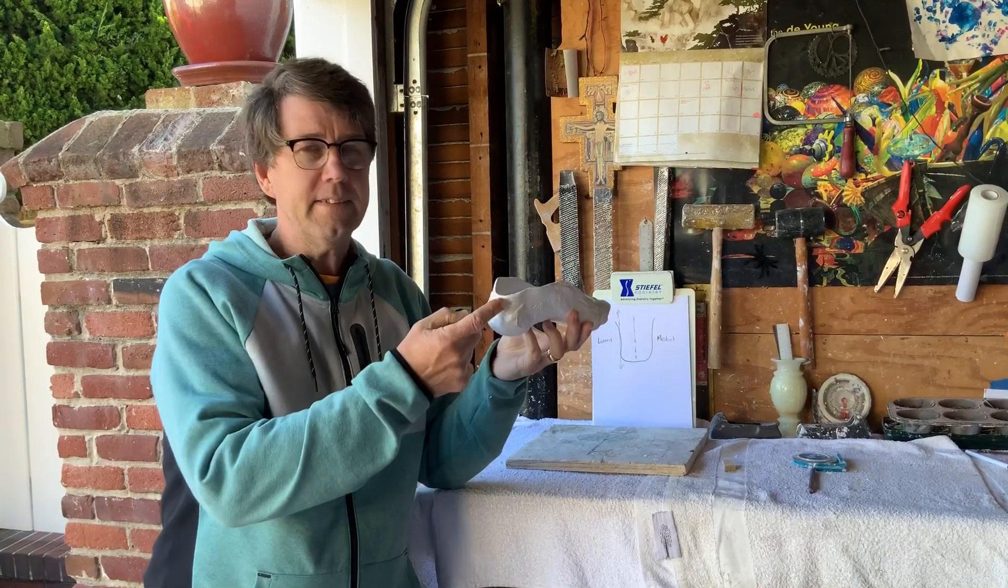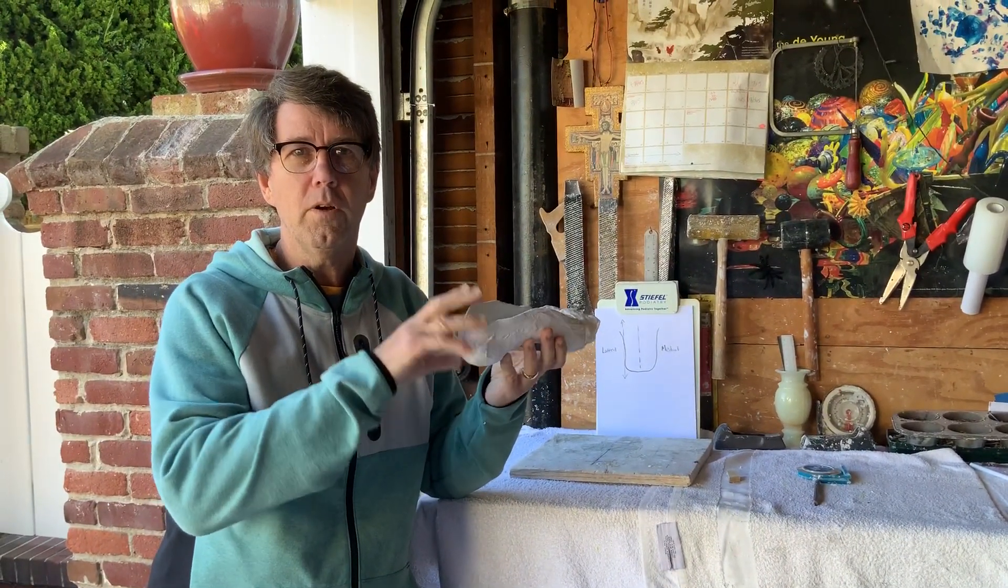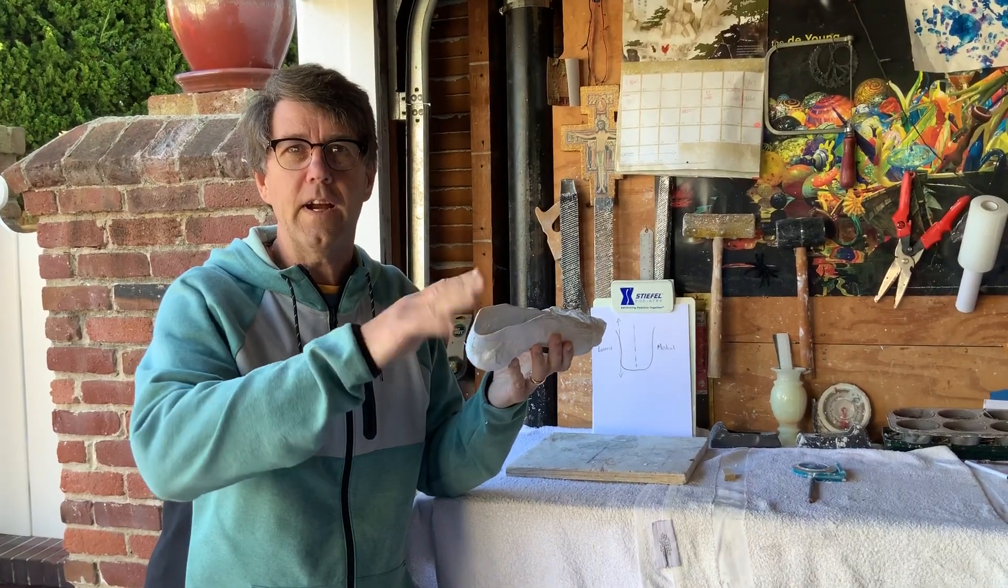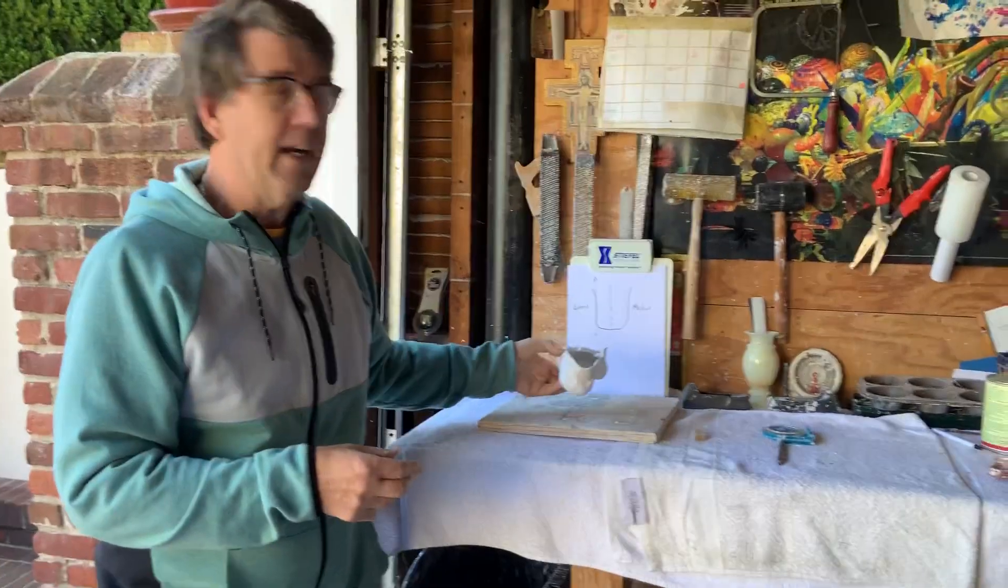The bisection of the heel is our reference point to whether the foot has a forefoot varus or forefoot valgus deformity.